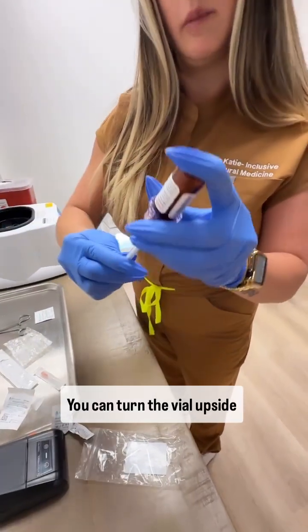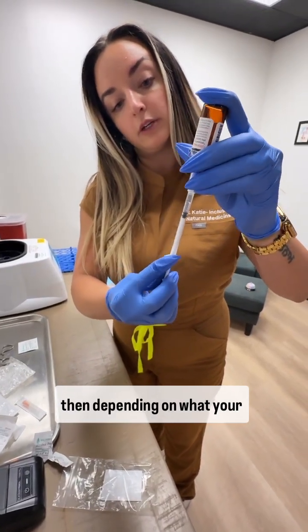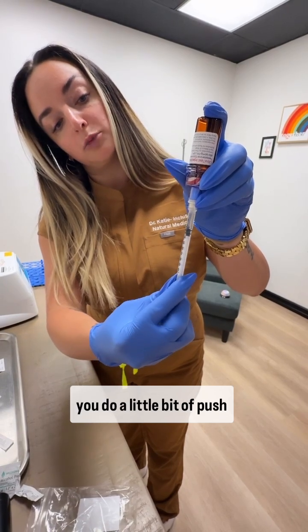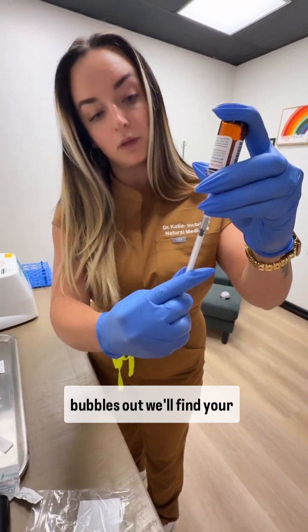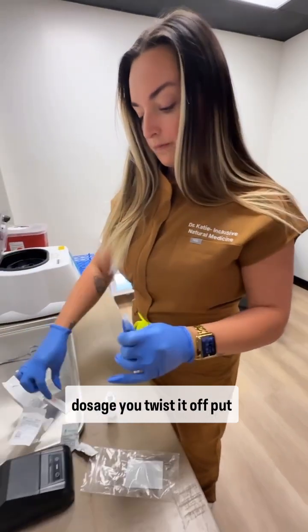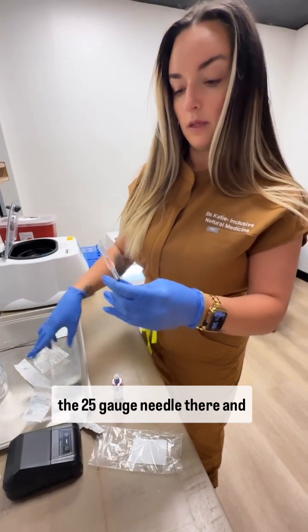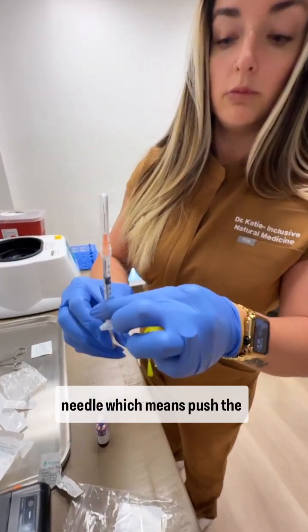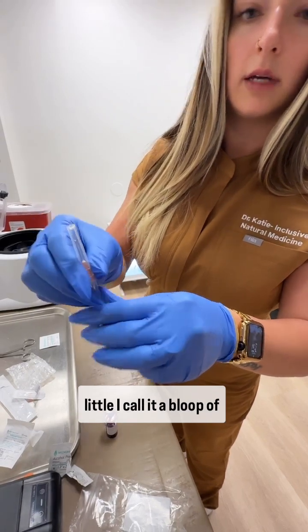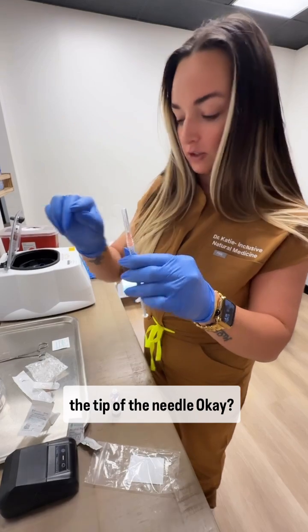You can turn the vial upside down so that all the liquid goes to the bottom of the vial. And then depending on what your dosage is, you'll pull back the plunger. And it's okay if you do a little bit of push-pull to get some of those air bubbles out. But we'll find your dosage. You twist it off. Put the 25 gauge needle there. And don't forget to prime your needle, which means push the plunger up a little bit until you see just that slight little, I call it a bloop, of solution that comes out of the tip of the needle, okay?